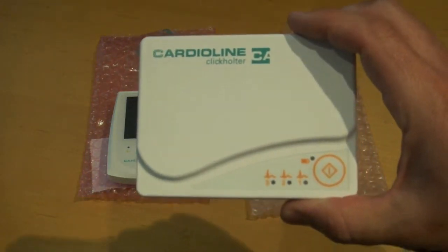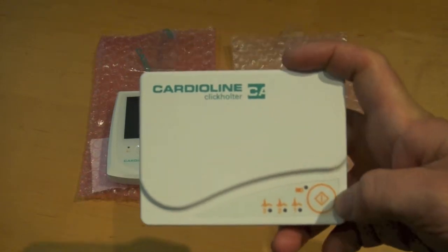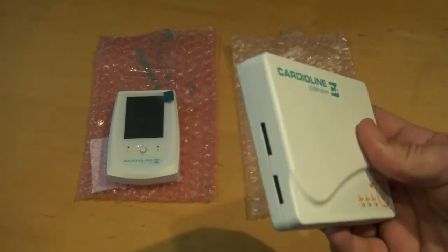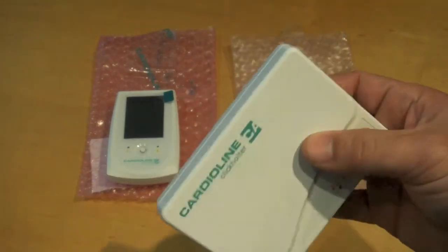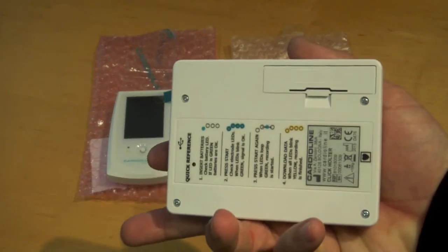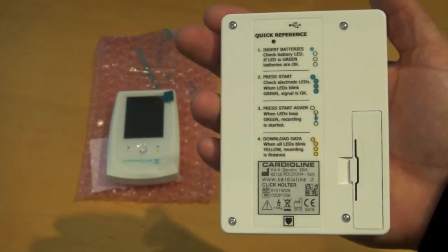The Click Holter has a 3 LED notification system, as well as a power button which functions as an event button and a battery warning. One side has a patient cable port, the other side is a USB port, and on the back of the unit is a spot for AA batteries, as well as a quick reference guide to starting the Holter.